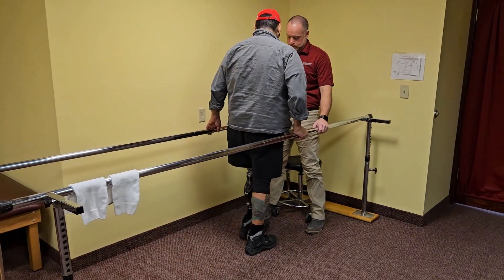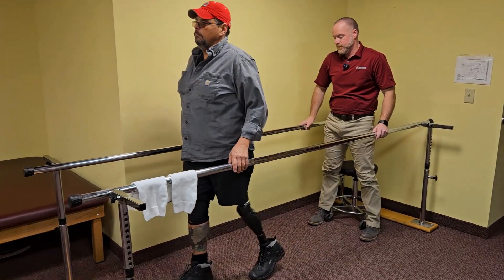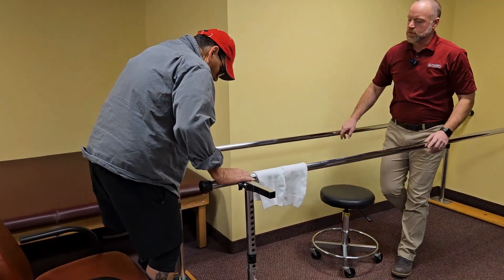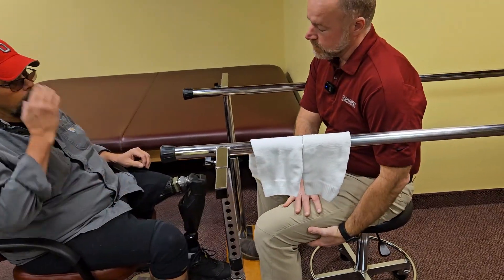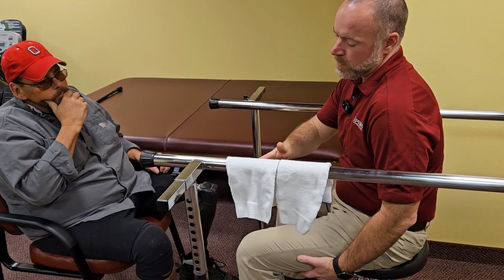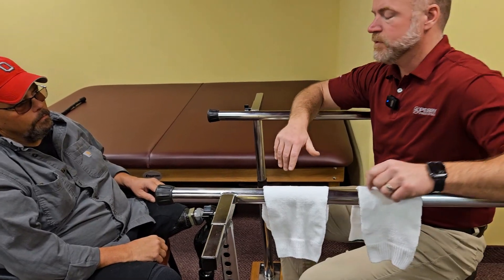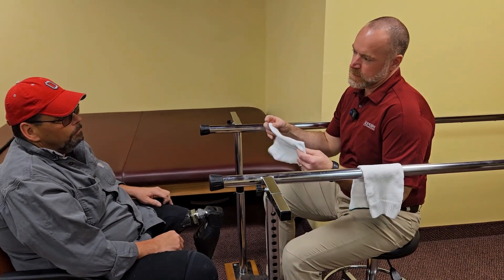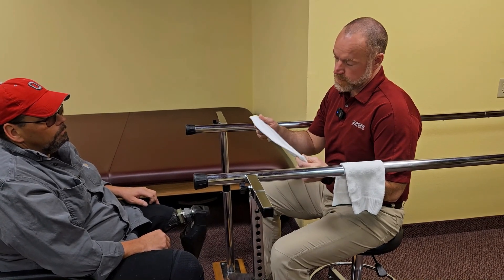Try to look up nice and tall — good job, looking good. So the next thing to talk about is socks. Most patients will start out with their limb at its largest in the morning, and as the day wears on — 8, 10, 12 hours of walking — you can lose volume. If you ever start to feel looseness that wasn't there in the morning, we have socks to help take up that space.